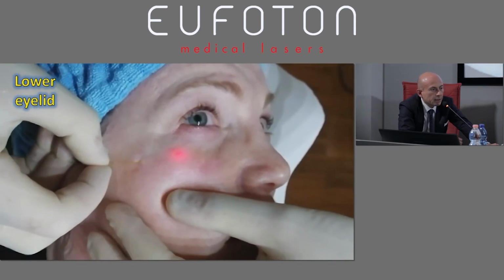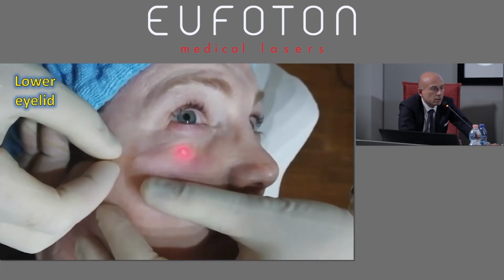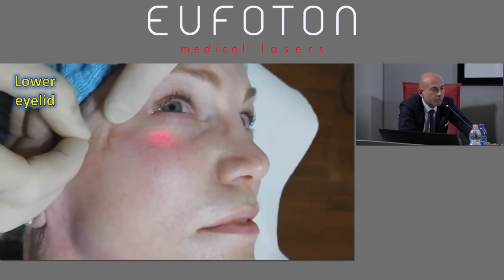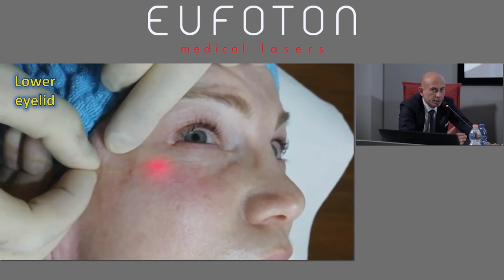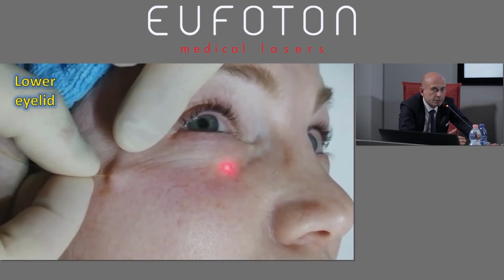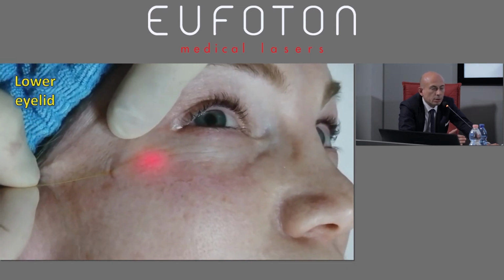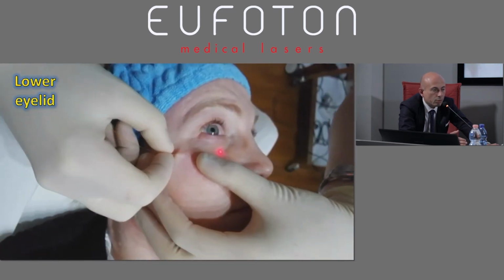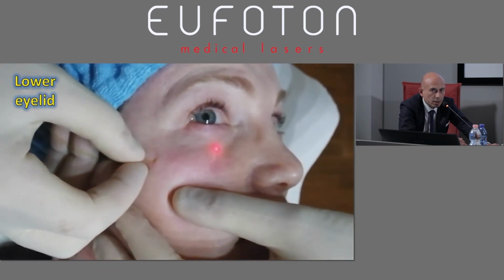Lapping, the mirroring effect, is distinctive of disposable fibers versus fibers sheared geometrically with ceramic scissors, which makes for a potential loss of 20-30%. When we use continuous pulse with wattages higher than 6 watts, this entails the formation of a deep carbonization.